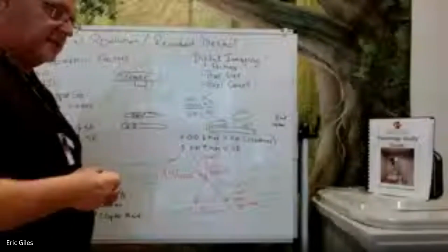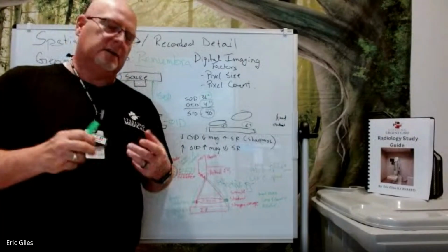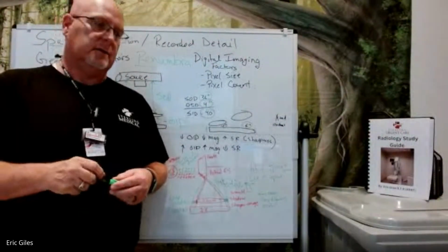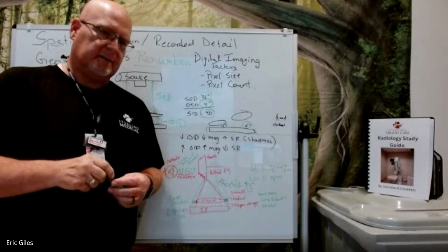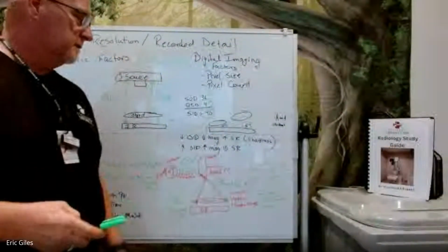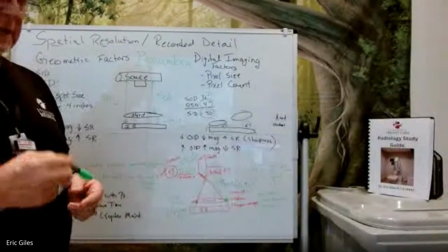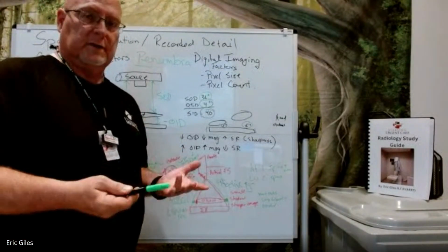Say you're doing a chest X-ray on a 3-year-old child. It's hard to get them to hold their breath. I've gotten really good about watching a child breathe and knowing when to expose that image, and the exposure is so fast that 9 times out of 10 you don't see any motion within the lungs. And the key to combating involuntary motion is exposure time. So the less exposure time, the better, or the more apt you are to not have involuntary motion.